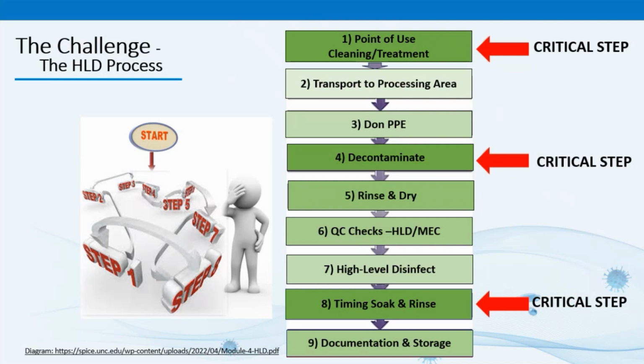In step six, those QC checks, they observed not performing QC checks on test strips and solutions according to the IFUs, not keeping test strip containers closed or marked as open and their expiration dates, and not waiting the correct amount of time to read the test strip, and also not reading that color change properly.